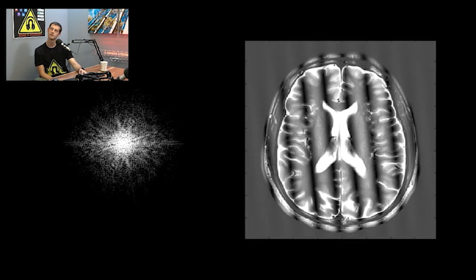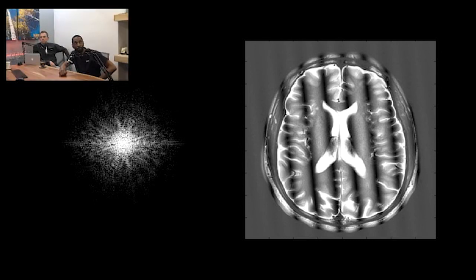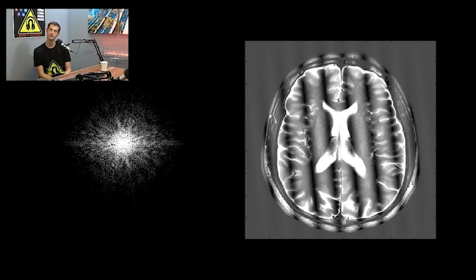Like this. Have you seen an artifact like this in your work? I have. Is this an example of when Kspace didn't get filled? It has several names. I know it as white pixel artifact. I know it as corduroy artifact. Corduroy because like the pants. Right. I call it white pixel because there's one pixel in there that is super bright.